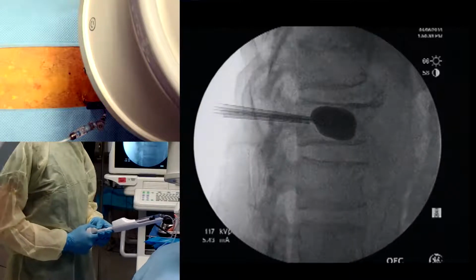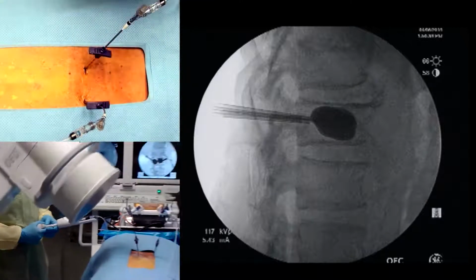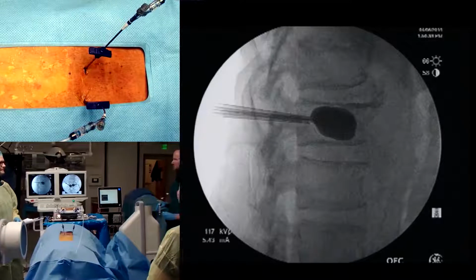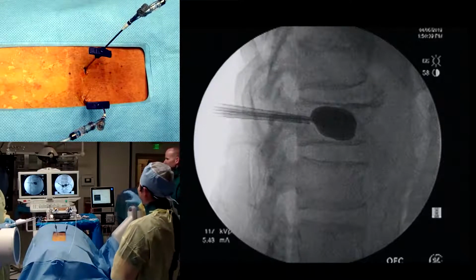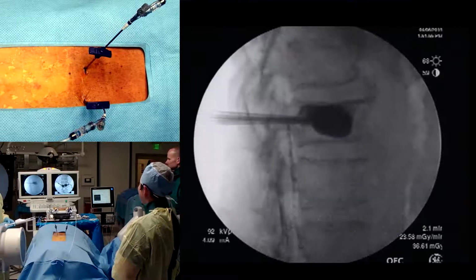So we'll suck it out with that. Okay. So that must mean that the balloon, well, you're rated for 5. We pushed the boundaries. We're rated for 5 there, actually. So we have radio opaque dye actually going, but let's see where it's at. Let's see where it went. This is really interesting.